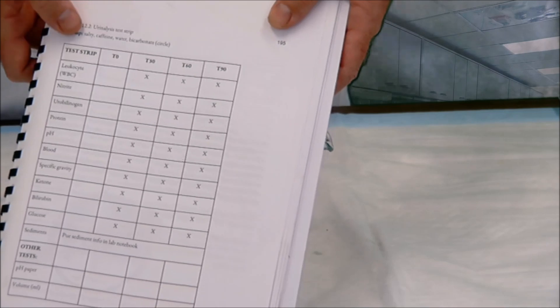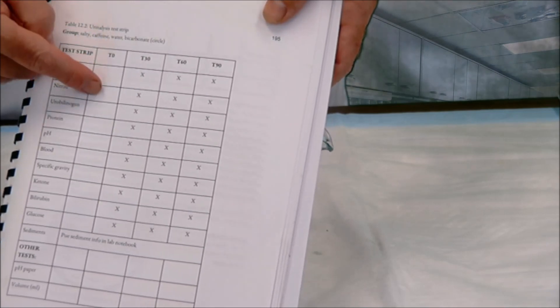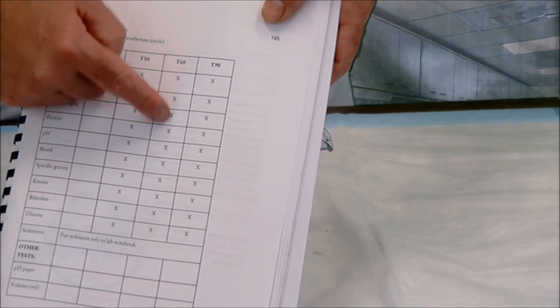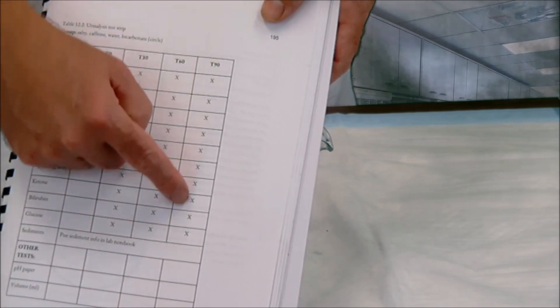So again, your initial urine sample gets recorded here at T0 times zero, the second one at T30, the third one at T60, and the last one at T90.